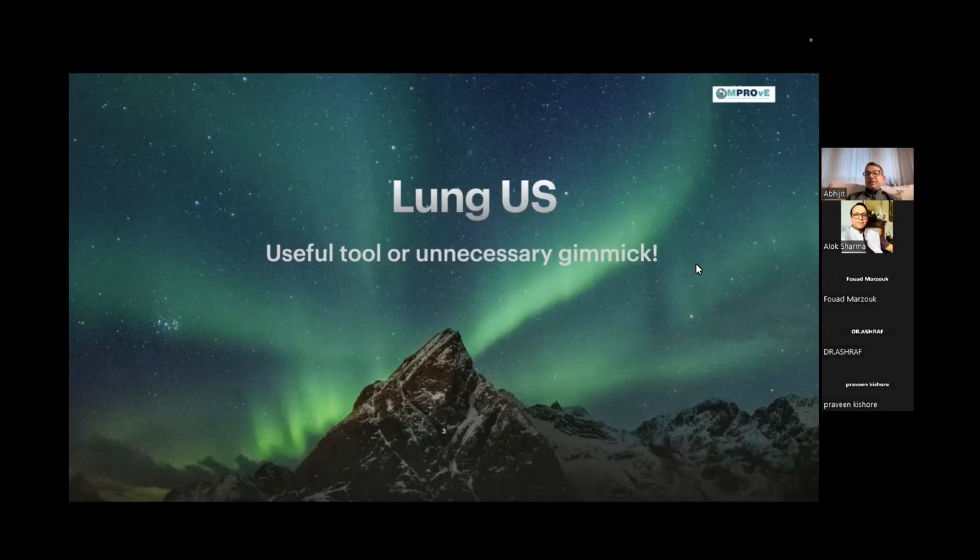But is it going to replace the chest X-ray? Not really at this point in time, because we're still learning, and because we have been using chest X-ray for decades, and contemporary teaching is always trying to diagnose the pathology on the chest X-ray. So it will take time, but eventually we will be using more lung ultrasound, cutting down on the radiation to the babies from the chest X-ray, and that is the goal at the moment.